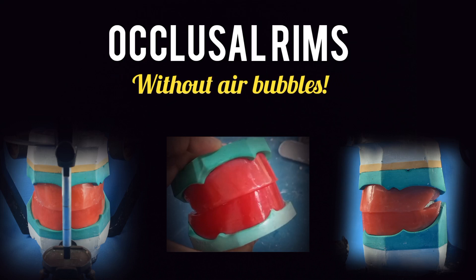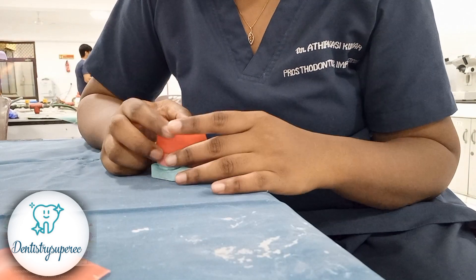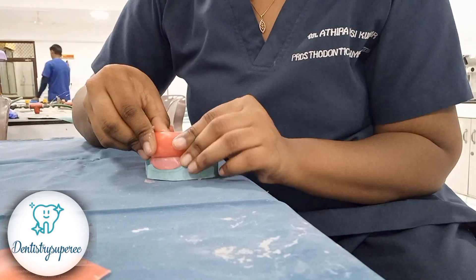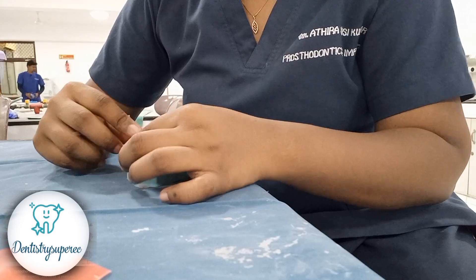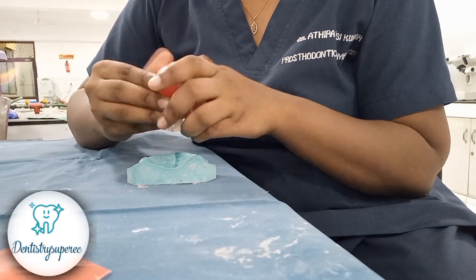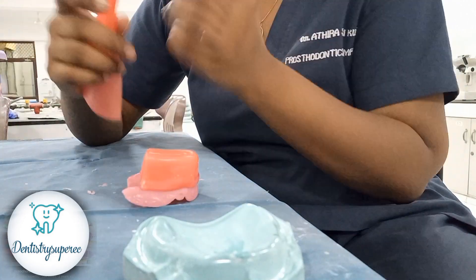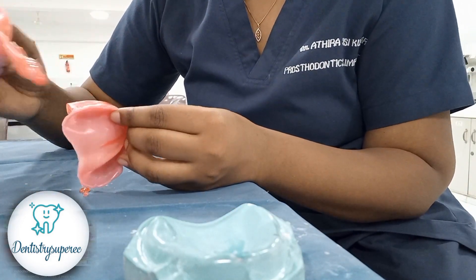Hello everyone, today we will be seeing fabrication of occlusal rims without air bubbles. We are starting off with the maxillary cast. I missed the video of rolling the wax, but that's coming up for the mandible. You have to roll the wax and place it — while placing you can give a 15 degree angulation slightly, but it's totally fine if you didn't, because we can add it later.